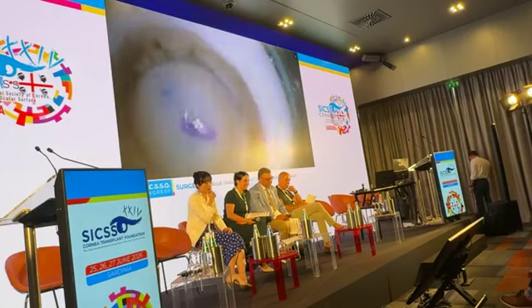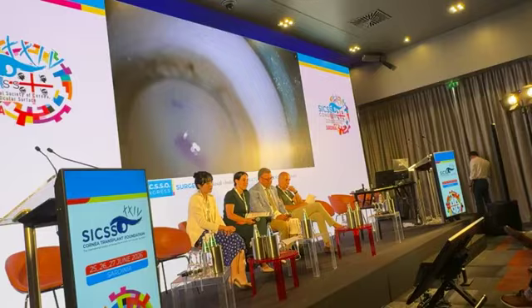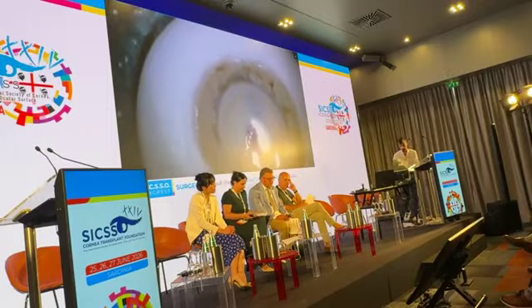So he is highlighting the center of the cornea before punching the cornea at the desired size. I want to see the edges. Give me a syringe of water. So you can see that the tissue is a pre-stripped tissue.